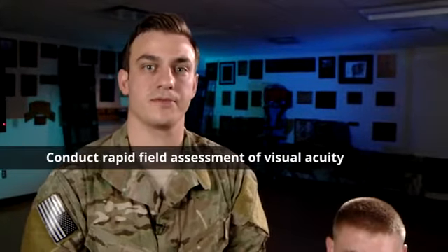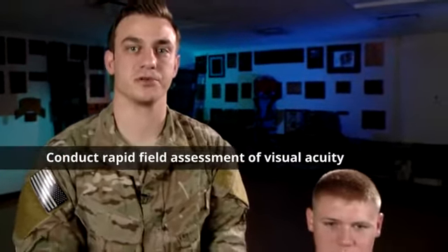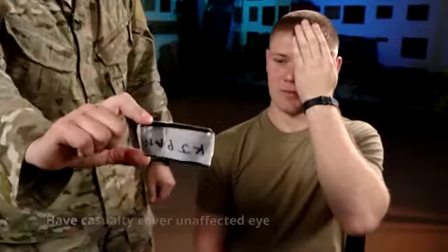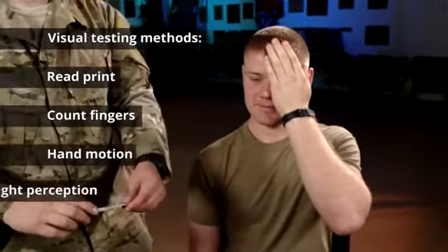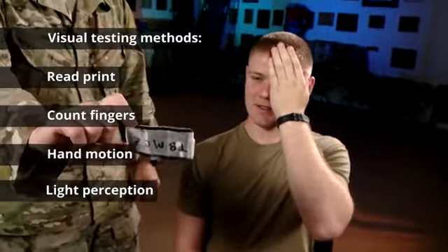Our first step is to conduct a rapid field assessment of the casualty's visual acuity. Please cover your unaffected eye. Can you read this card? I cannot. Can you read this card? I cannot.